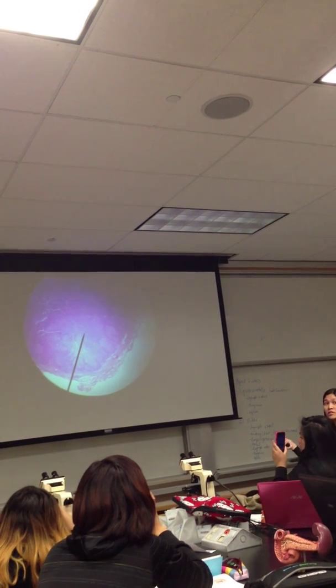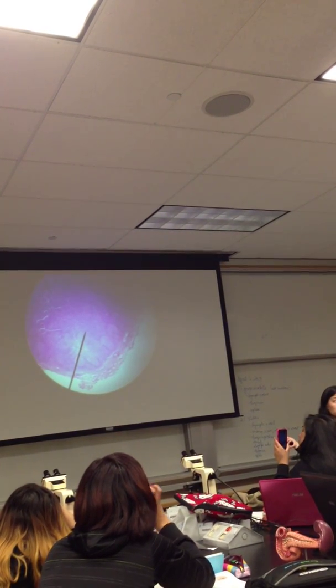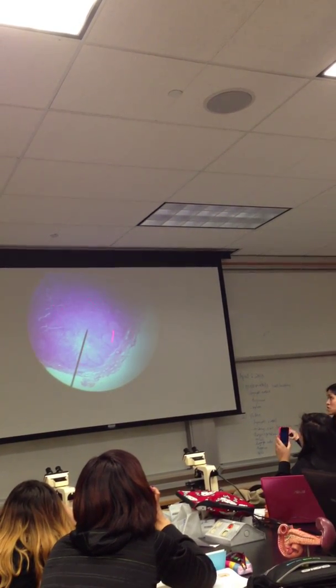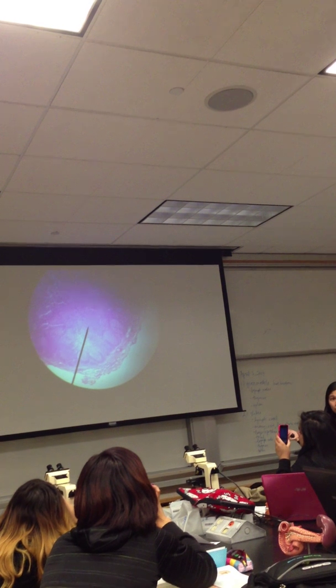You also see another one here. So you shouldn't confuse this with a tonsil, right? Do tonsils have those vessels? No. Does the tonsil have a thick capsule? No. Okay, so this is your lymph node.